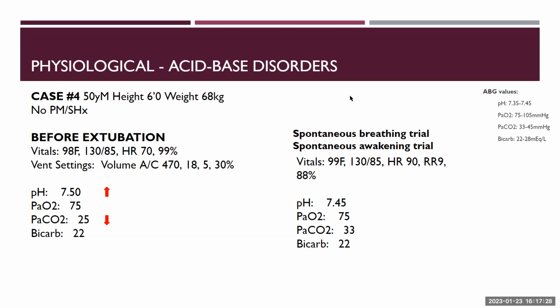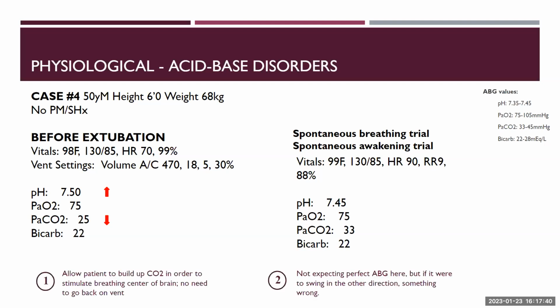So you see these vitals and you get a little concerned about the oxygenation and the respiratory rate, but you did just wake him up after him being really comfortable on the vent. So this is a patient to watch and continue to follow trends to make sure things aren't swinging one way or the other, in the sense that we might have to re-intubate this patient. So keep an eye on how well the patient is maintaining themselves off of the vent.